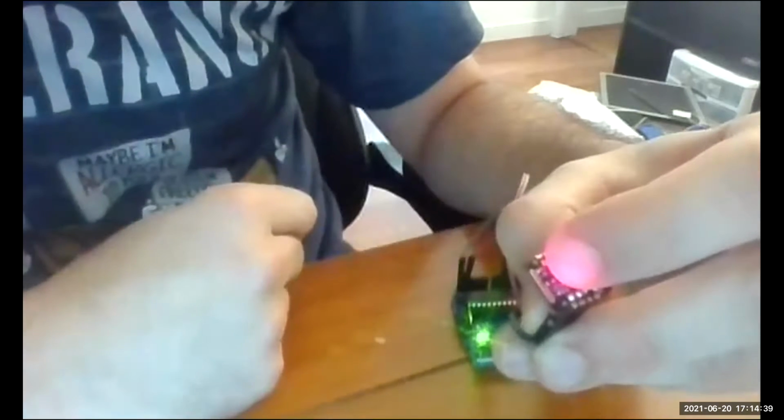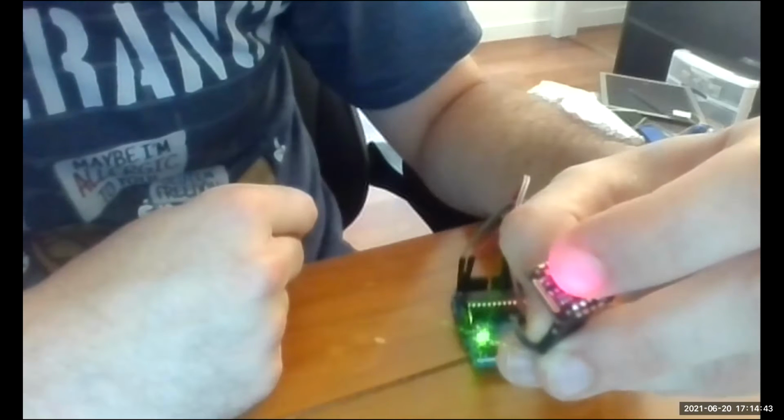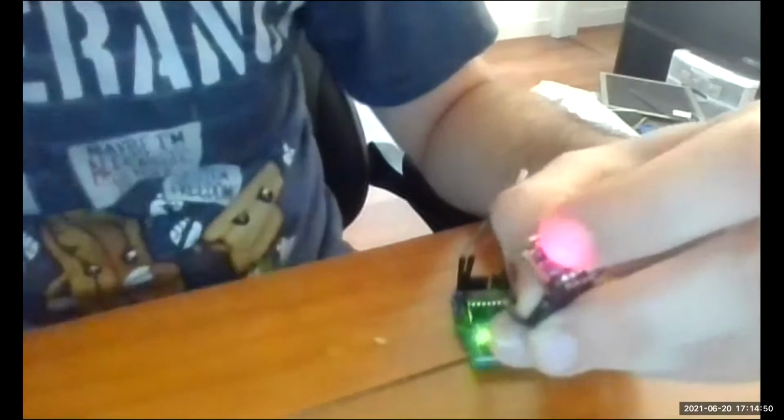The pulse sensor is actually sending out infrared light. It's bouncing off of the hemoglobin and is absorbed at different rates based on if your blood is oxygenated or not oxygenated, and it's picking up that small difference in signal. So let's go ahead and look at what the output of your sensor would look like.